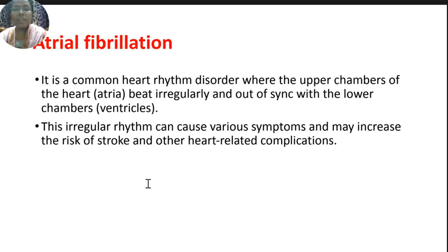So if any shoulder pain occurs, we need to immediately go and check the ECG, and if any ST segment elevation is seen in an ECG, we should immediately go to the physician and take care of first aid, so that we can avoid the serious consequences of the heart attack or acute myocardial infarction. In the same way as ST elevation, ST depression is also one kind of abnormality. This ST depression indicates myocardial ischemia.